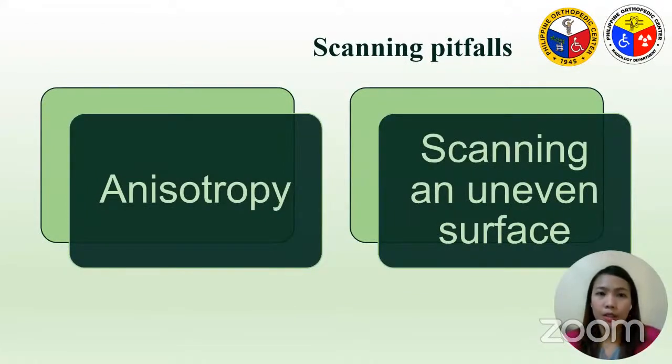There are various potential hazards or challenges that sonographers may face when doing a shoulder ultrasound. These issues can have an impact on image quality as well as diagnostic accuracy. Anisotropy is the phenomenon where an ultrasonic beam affects tissues in different ways based on how it hits them. It can give wrong or uneven results, especially when tendons are being looked at. You can lessen this effect by changing the angle of the probe, rocking the transducer, or by using dynamic scanning methods.